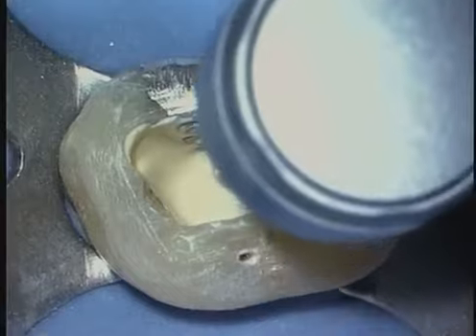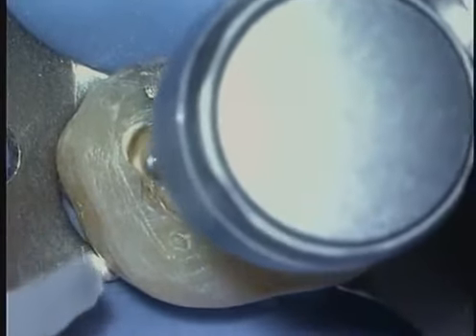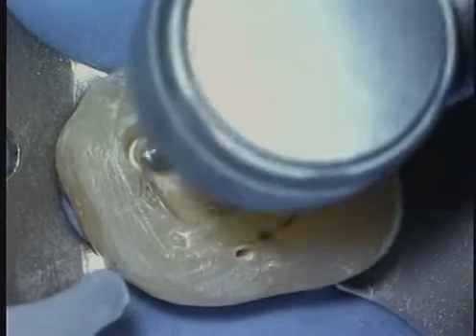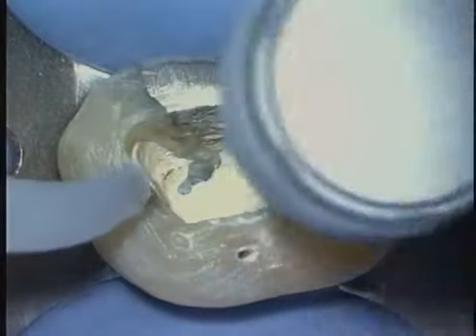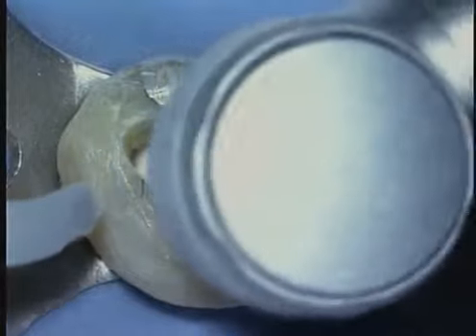Picking the access up in progress, you can see the same kinds of attention to detail need to be followed from case to case. We need to disassemble and remove all the previous restoratives. Getting the restoratives out of the tooth is going to give us the vision we're going to need to begin to chase for extra canals.